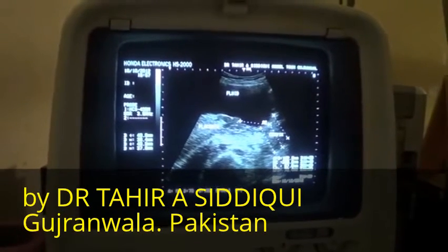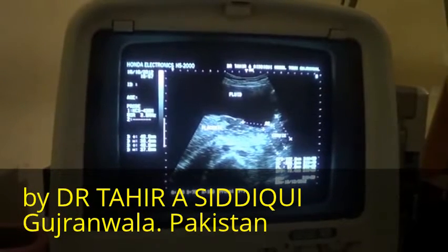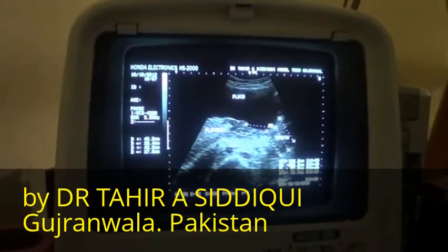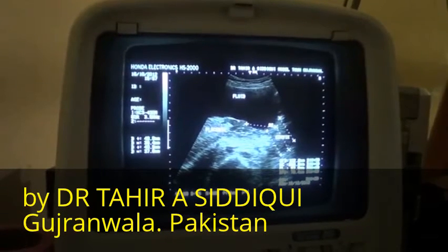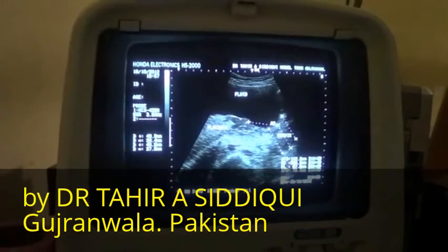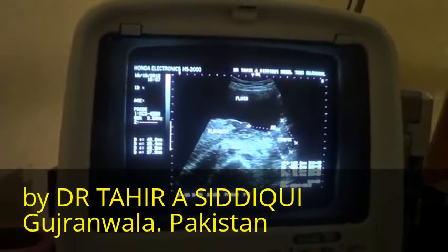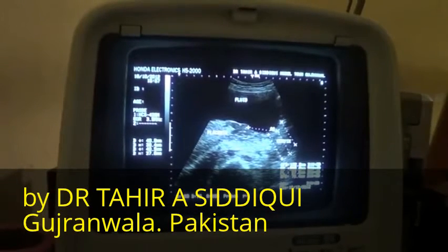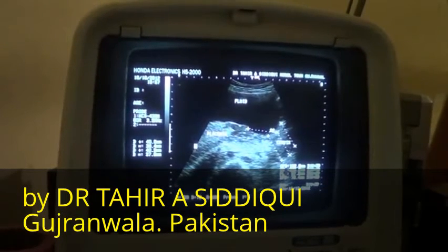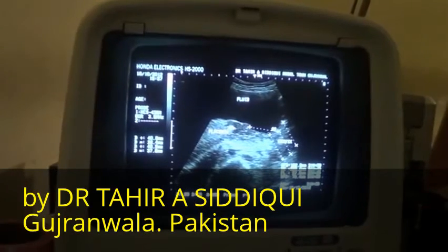Occipitofrontal diameter is 102.9 millimeters, corresponding to 31 weeks plus 3 days. Calculated gestational age is 31 weeks 2 days, and the expected date of delivery is 16th of December 2012, with posterior low-lying placenta.